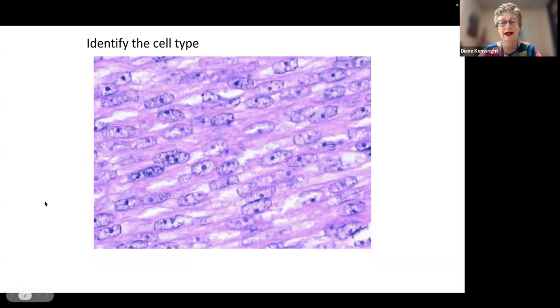These are also spindle cells. So these in the olden times would have been called spindle B cells, but they're just spindle cells now. They have small blue nucleoli, are still ovoid and kind of seem to stream across the slide.